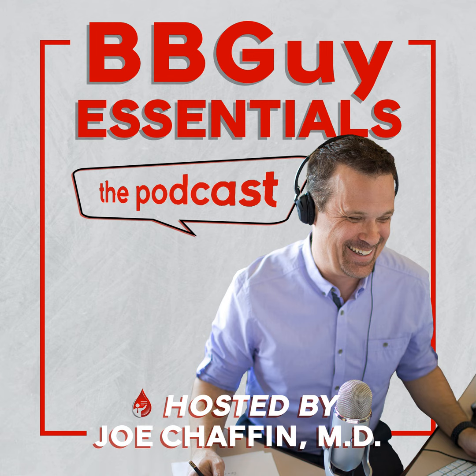Can I ask you what you use in your lab, actually, in your reference lab? We do use EGA in our reference lab. I do know many reference labs in the US that don't, but for us, we feel like it avoids as many adsorptions sometimes with strong autoantibodies. So that's the logic behind it anyway. No, it is good logic, and I think that it certainly can be recommended.